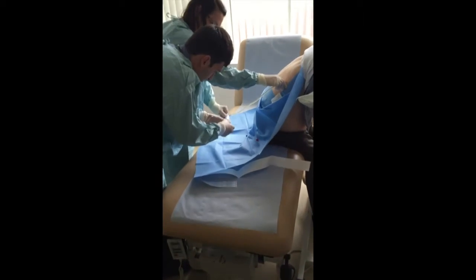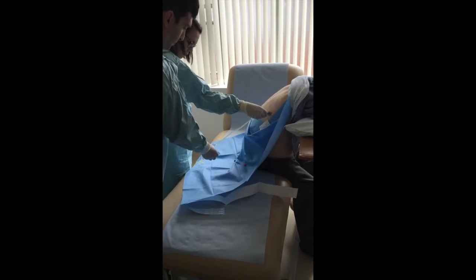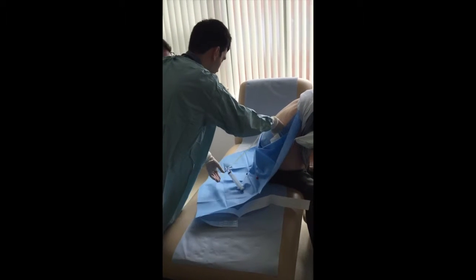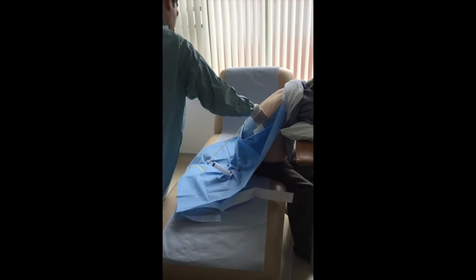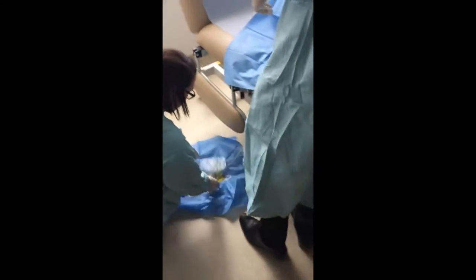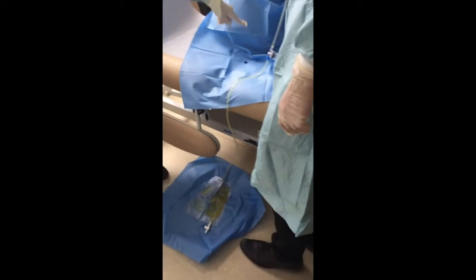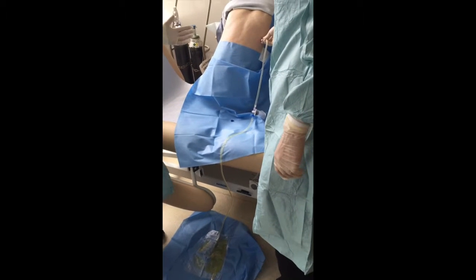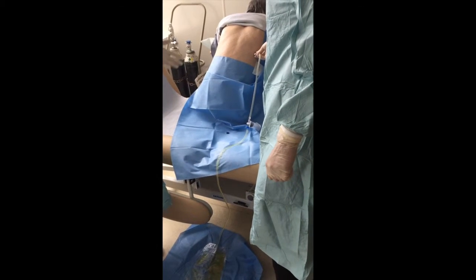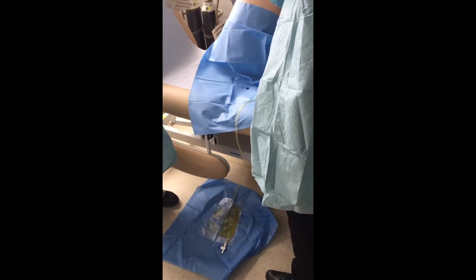So what we can do is we can just close that off to the syringe now, and you can just let it really drain. Good flow there, can't you? Yeah. So if you hold the cannula there, you don't need to hold the syringe particularly. And then if you just come and have a look at the fluid coming down into the bag here, what you can see is a really nice flow of fluid, and it's just draining into this bag. Now the effusion's really clear, so there is a possibility this could be a transudative effusion, but we really need to see the pleural protein to be able to say that for sure.